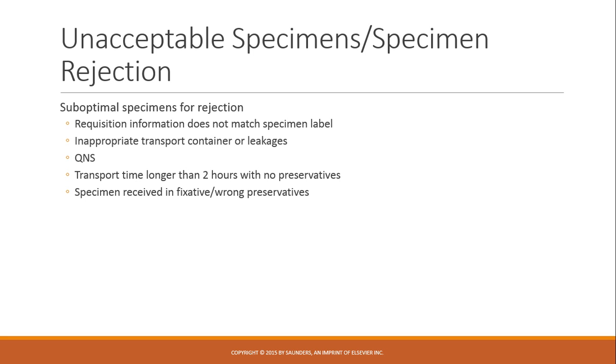Transport time longer than 2 hours with no preservatives. If it's 9 p.m. at night and you get a urine culture and the urine was collected 6 a.m. that morning, it's not good anymore. It's been sitting at the patient's bedside stewing all day long.